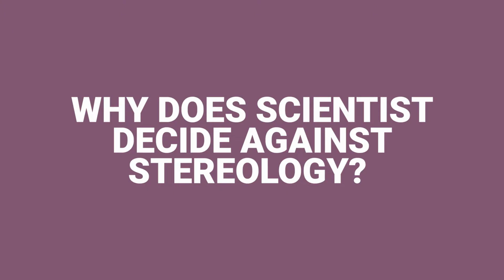So that brings me to my third question. Why do scientists decide against stereology even when they shouldn't? And it's not some scientists. I have never done stereology, and I'm now coming up with an example. Hey, we should do this. Why are we not doing it? Well, what's the problem there? It is more time consuming, and it will slow your project down.